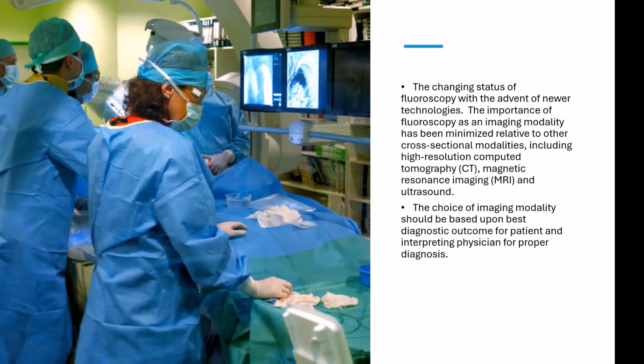The importance of fluoroscopy as a diagnostic tool has been minimized by other imaging modalities such as cross-sectional modalities, including high-resolution computed tomography, magnetic resonance imaging, and ultrasound. The choice of imaging modality should be based upon the best diagnostic outcome for the patient and interpreting physician for proper diagnosis.